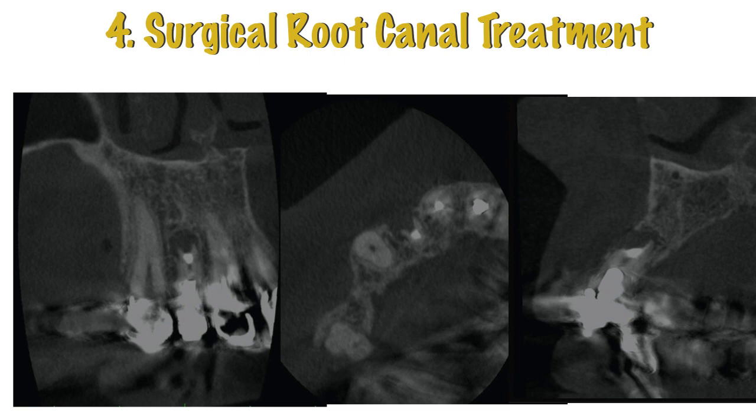So it gives us all this information: how the tooth was cut, how much bone there is. Do I have to chase the root here? No, because there's already rupture of the cortical bone there. It's a very short tooth, so I know I can make my measurements here and be more conservative.